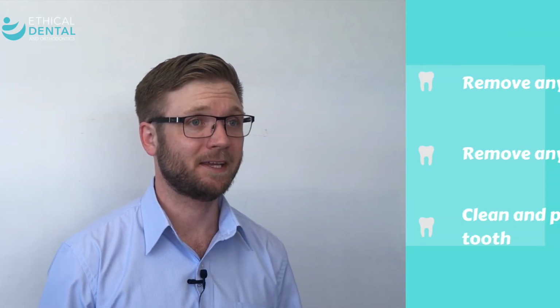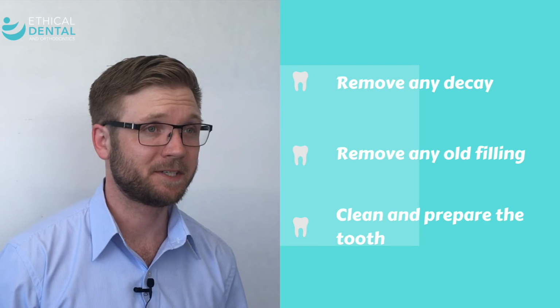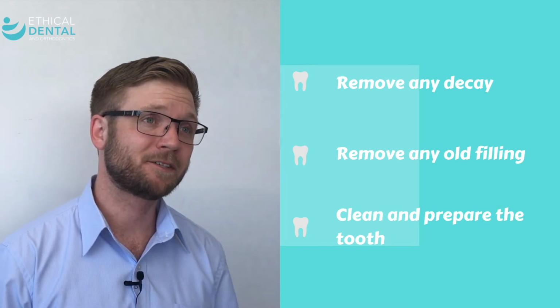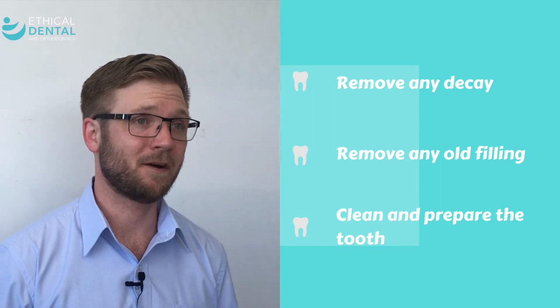So when it comes to actually doing the filling, the steps are pretty much the same no matter the size. So firstly, what we're doing is we're removing any decay, we're removing any old filling material, and we're preparing the tooth structure to receive the filling. We're cleaning everything up so we've got a nice fresh environment in which to bond the filling to.